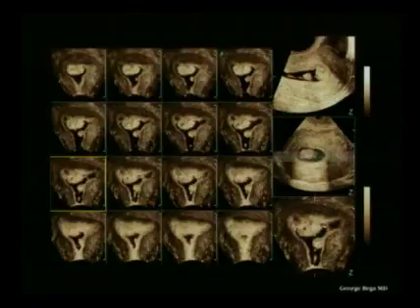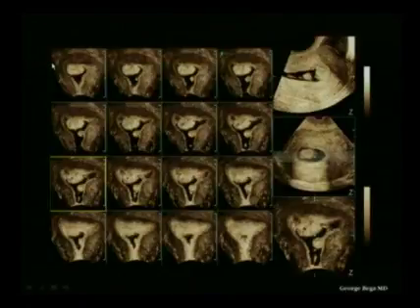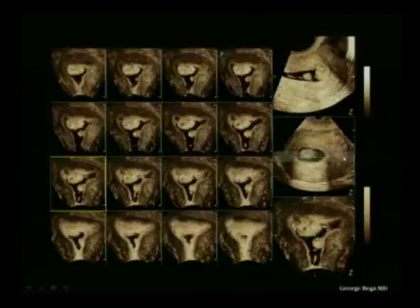Now, a tomographic display simulating CT and MR has been introduced by many manufacturers. Here, a volume is being displayed in a layout that will display several 2D slices in a grid that is operator selectable.